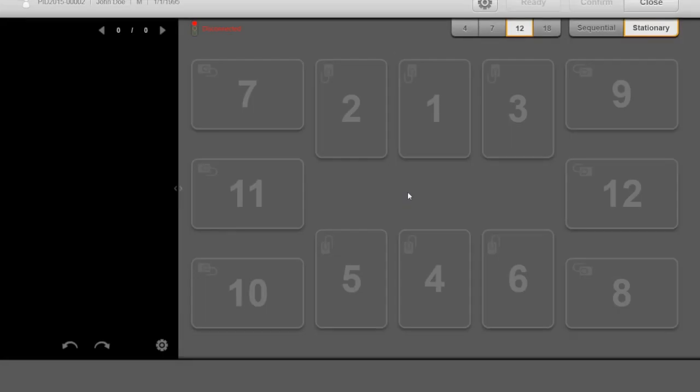After checking the patient's information, you will see the main window of Rio View. The desktop is where images are displayed when they are being viewed or captured from an external source. This is the sensor indicator. It provides the connecting information of the sensor at all times. This is your teeth selection tab.